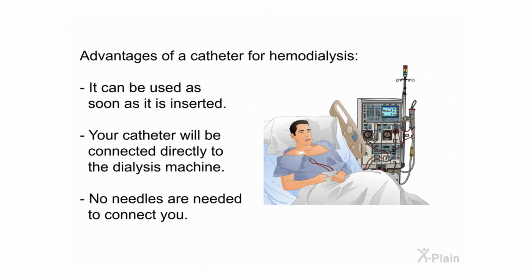Advantages of a catheter for hemodialysis. It can be used as soon as it is inserted. Your catheter will be connected directly to the dialysis machine. No needles are needed to connect you.